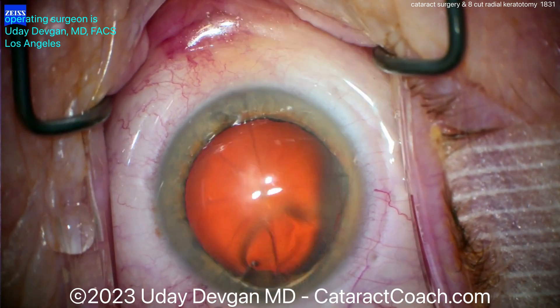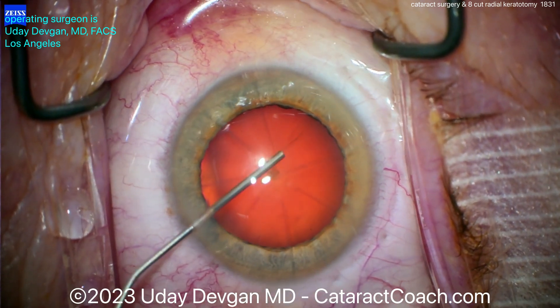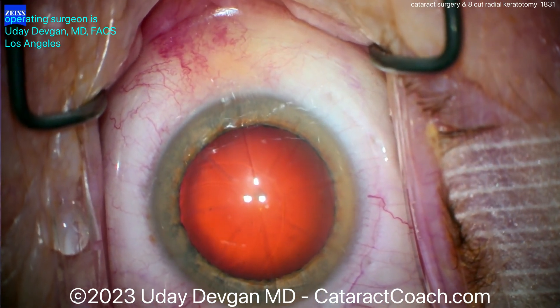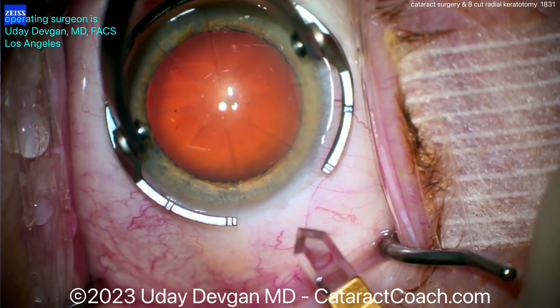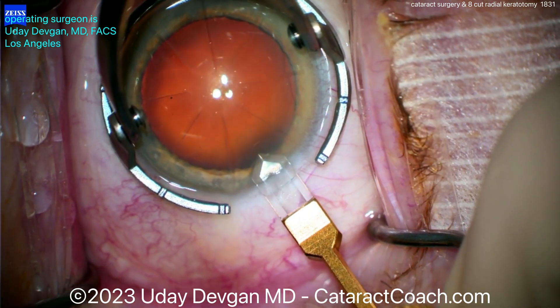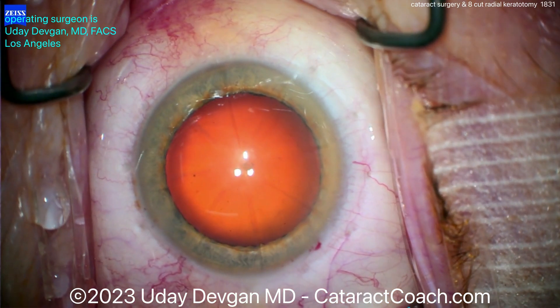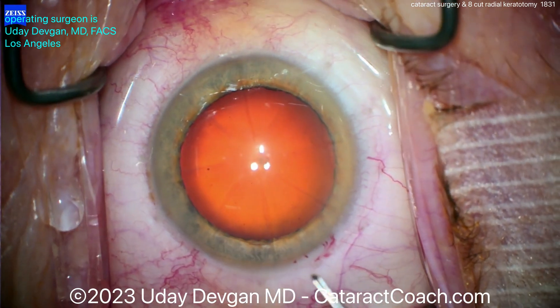This patient has a very clean eight-cut RK done many years ago, and also had LASIK done. Notice how the paracentesis is made between the two RK cuts on the left-hand side. The eye is filled with viscoelastic. Using a diamond keratome at 2.2 millimeters, we make the tunnel length a little shorter. You do not want to intersect the RK cut — squeeze that incision in between the two existing RK incisions. Do not touch them.